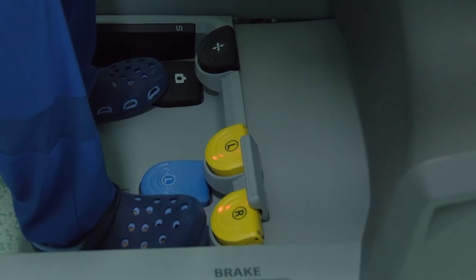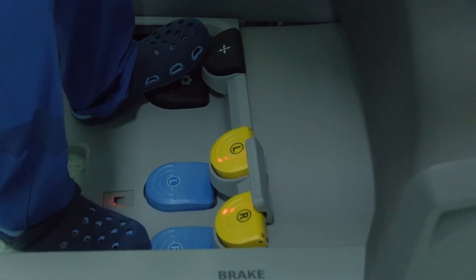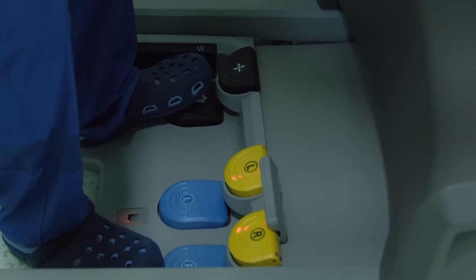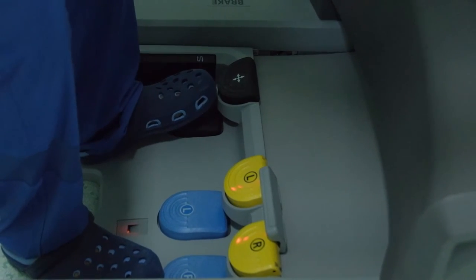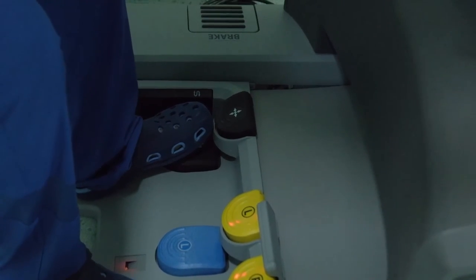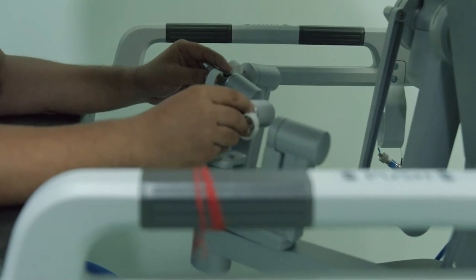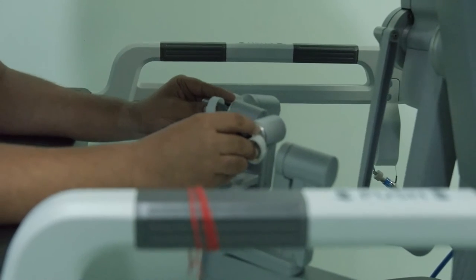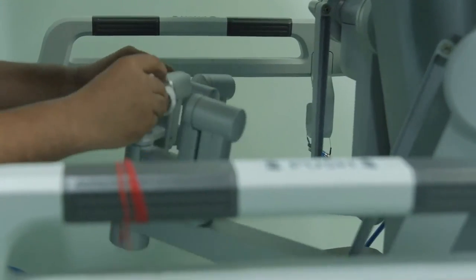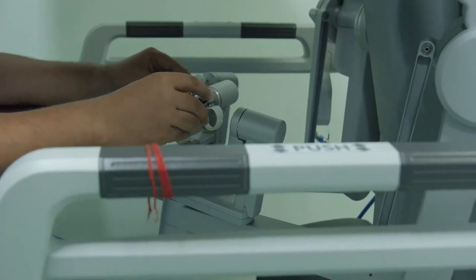You need to be sure. This is a swap pedal on my left side, and this is used to swap between the various instruments. So now I have swapped from third to fourth arm and I can swap it back to the third arm. It is also used for some other functions like reassigning the master controller or the hand controls to various instruments. This is the clutch button. As soon as I press this clutch button, my hand controls become free. I can move them in space without moving the tip of the instrument. So I can readjust the hand controls and then I can leave the clutch button.